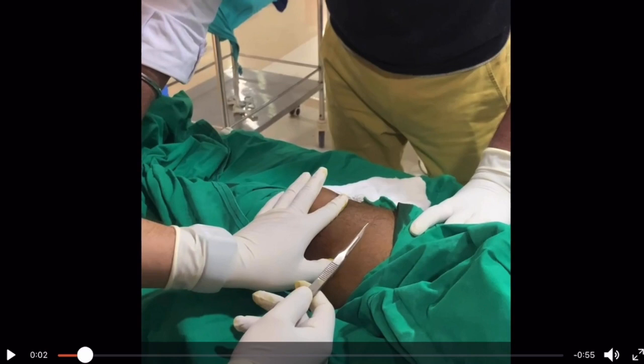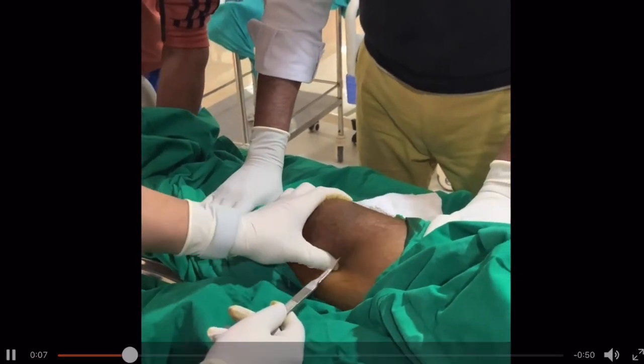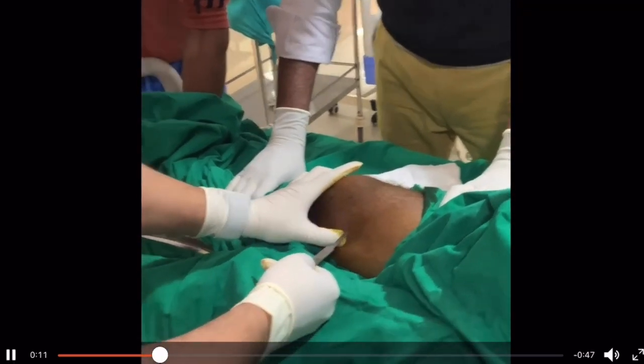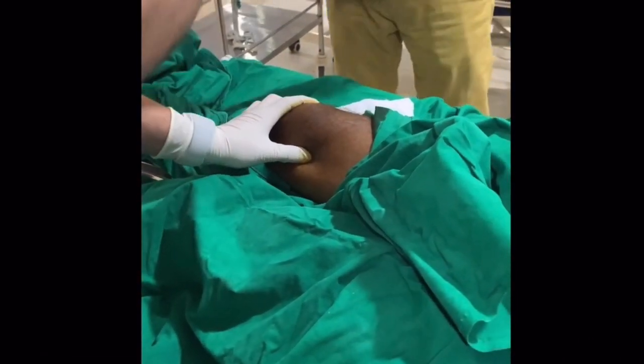I have elevated the right limb, in which I am going to put the pin, with two pillars so that the left leg doesn't interfere. I mark the superior pole of the patella and palpate the anterior and posterior border of the femur. Now I am going to give a stab incision — don't go too deep, just incise the skin.